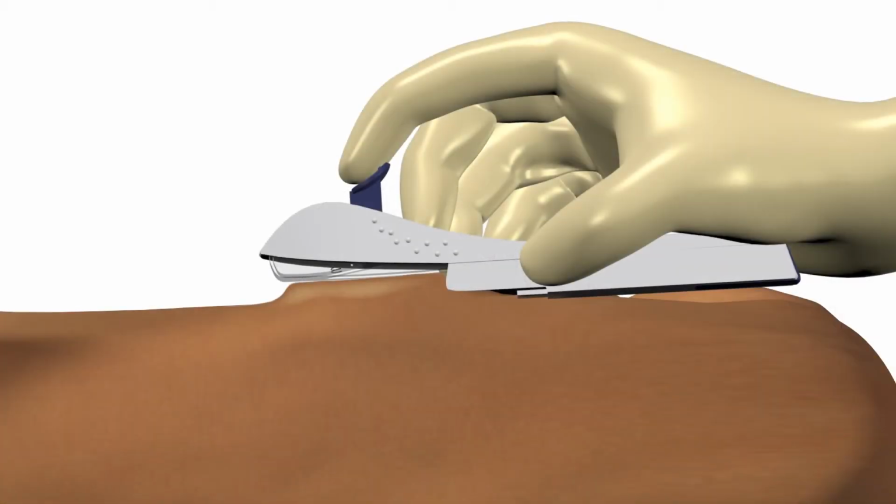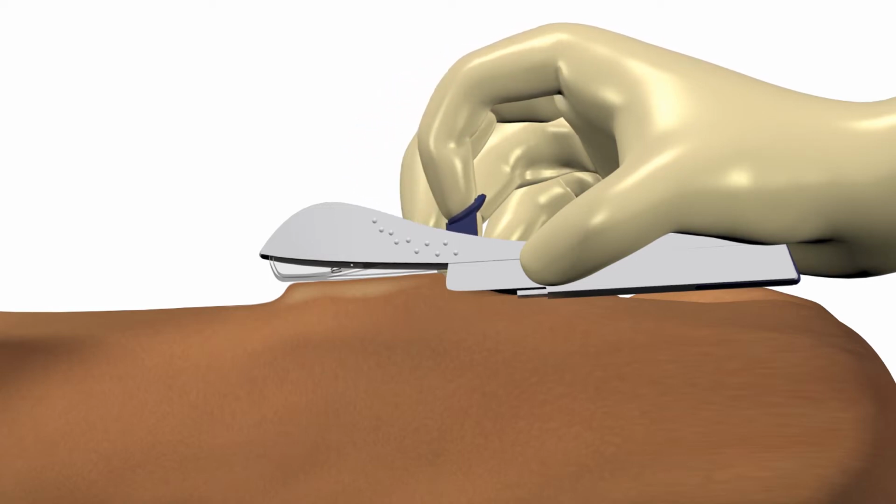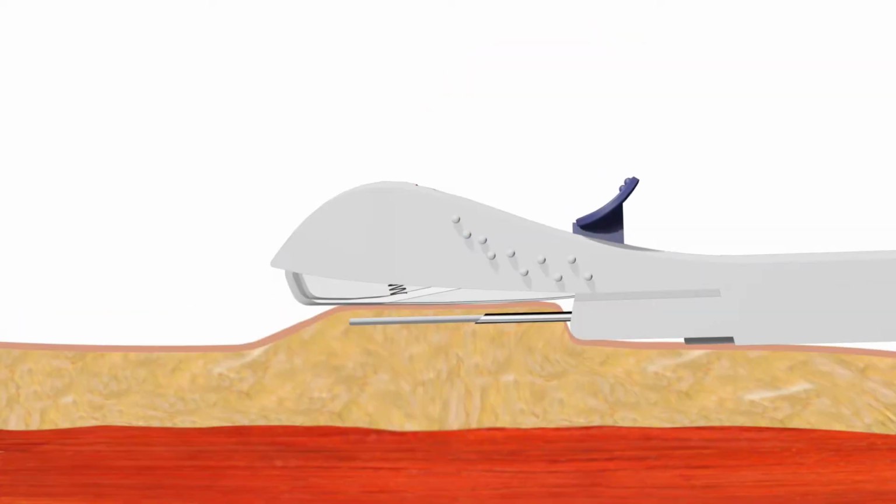Keep the applicator in the same position and unlock the purple slider by pushing it slightly down. Move the slider back until it stops. This will cause the needle to be fully retracted.